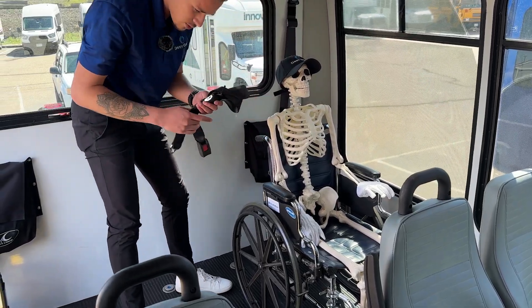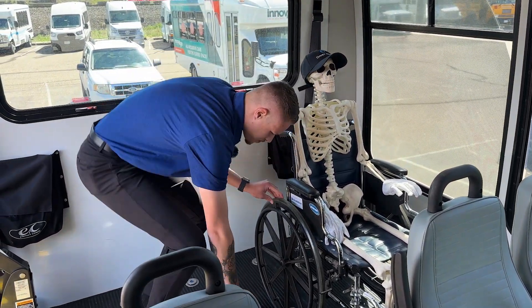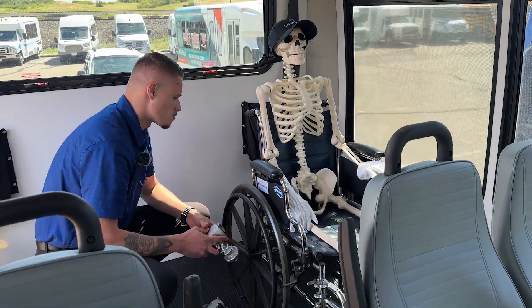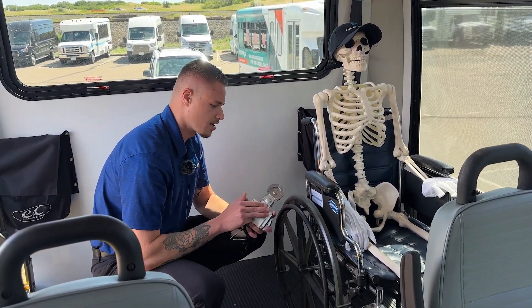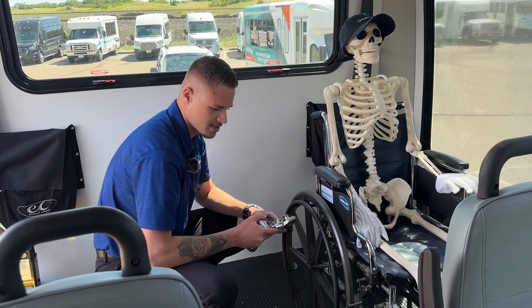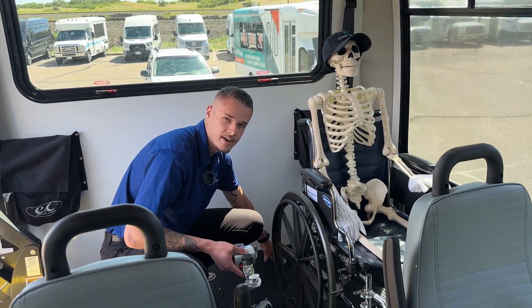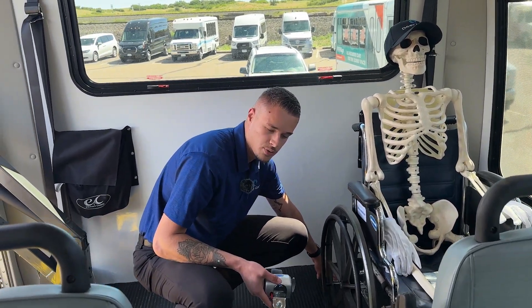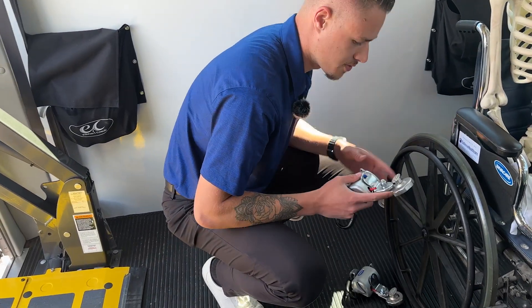You'll also have the lap belt, which we'll connect here momentarily. I like to start with the back of the wheelchair first and make sure that's nice and snugged up. The QRT Max securements feature a slide and click system — you don't have to run into issues with L-track corroding to itself within the floor. It's a clean system that pivots and auto retracts for you.